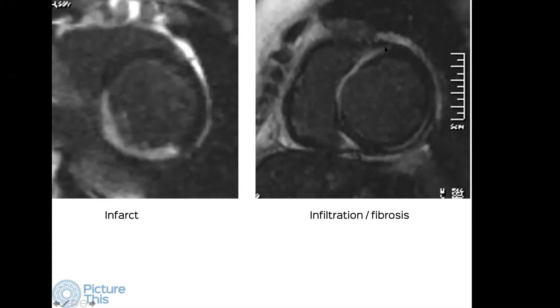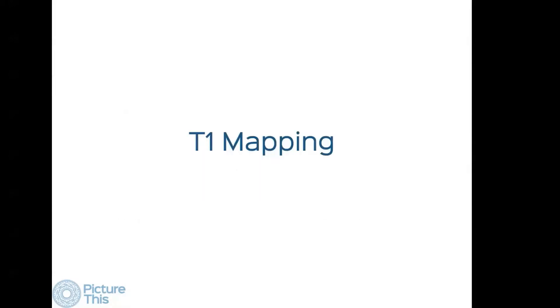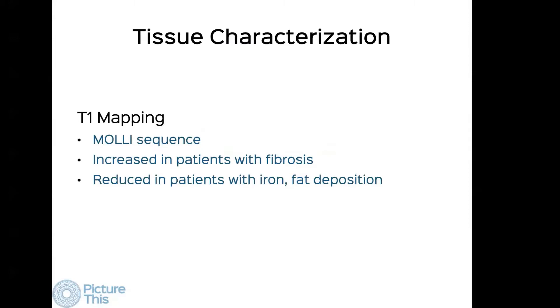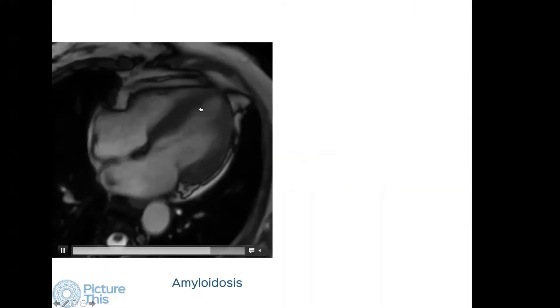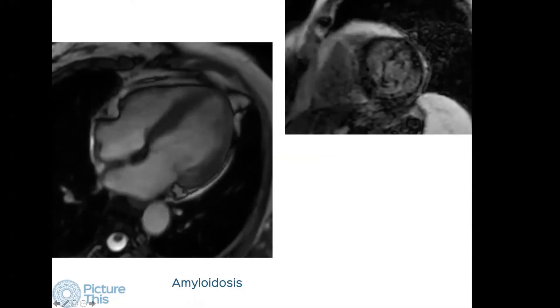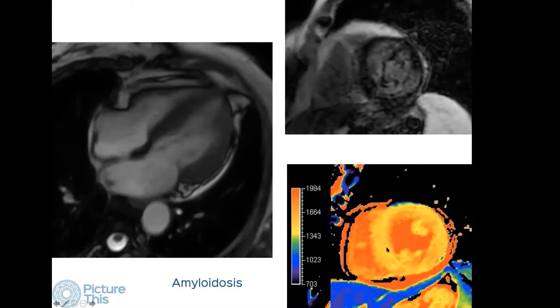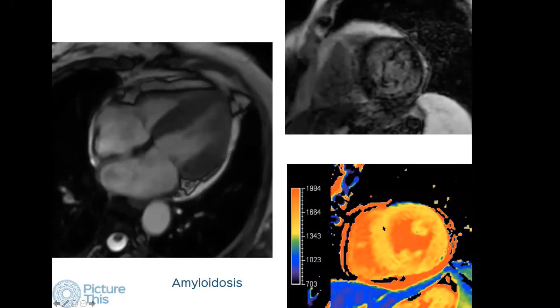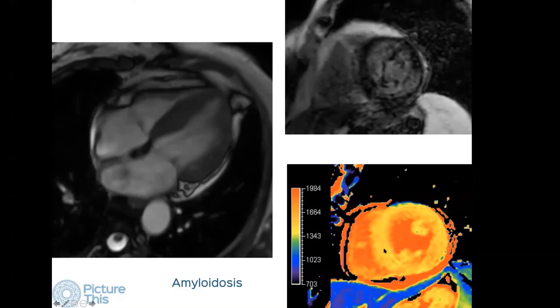On the short axis view in the anteroseptal segment you can see transmural enhancement, but as it moves into the anterior wall it becomes more epicardial or mid-myocardial. The other sequence is T1 mapping, which looks at a specific T1 property — increased in fibrosis and reduced in iron and fat deposition. Here is a patient with amyloidosis: there is myocardial thickening on the four-chamber view with relatively maintained systolic function. The LGE shows patchy abnormal subendocardial enhancement, and the T1 is greater than 1400 milliseconds — normal is 1295 in our setup — which is very characteristic of amyloidosis.